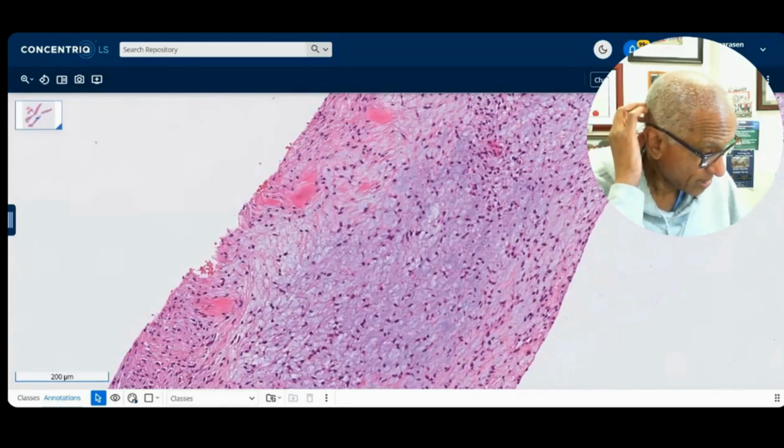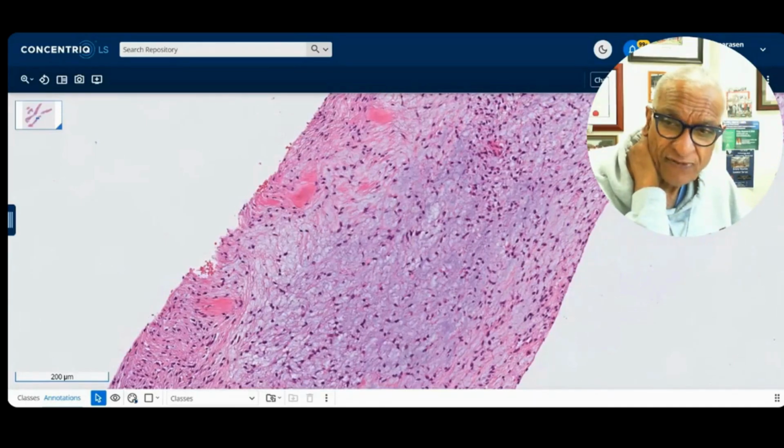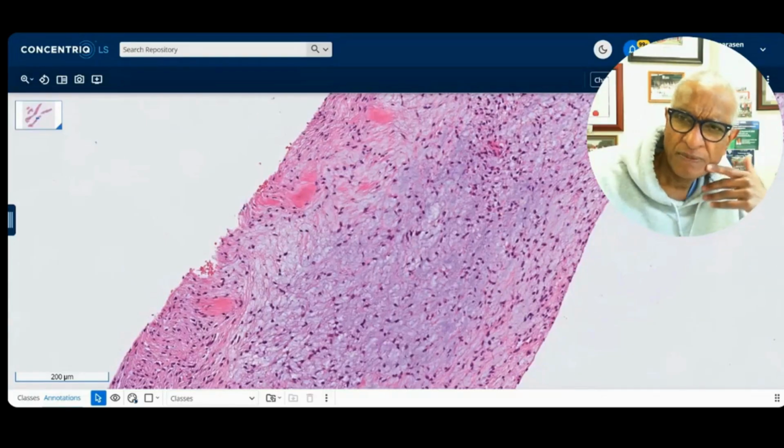Again, no markers for it, but there is a FISH analysis for chondromyxoid fibroma, in which GRM1 is fused. I hardly ever use it because I use radiology and morphology. Typically around the myxoid areas, you get these hypercellular areas. You might even get some osteoclast-like giant cells. So good thought, but this has no relationship to bone. But I admire your morphological interpretation.